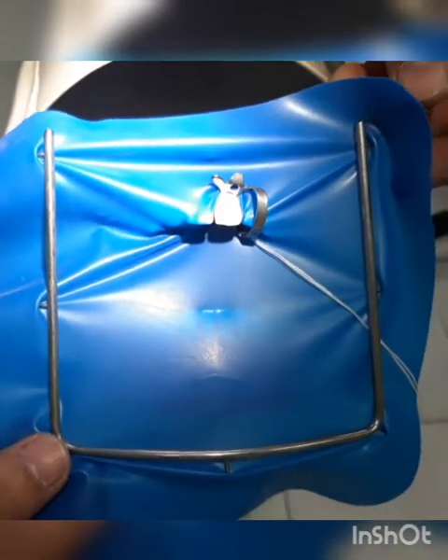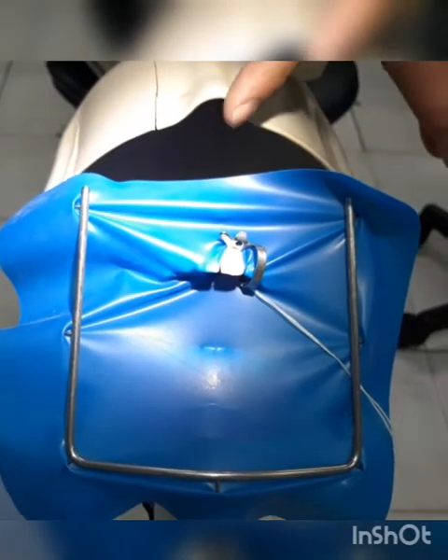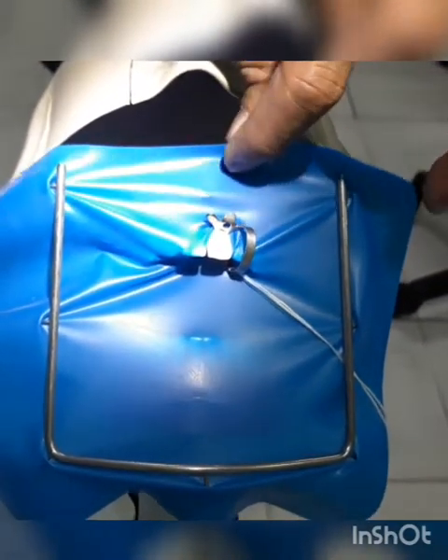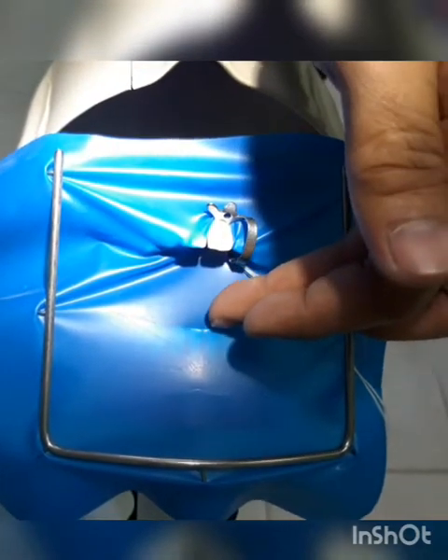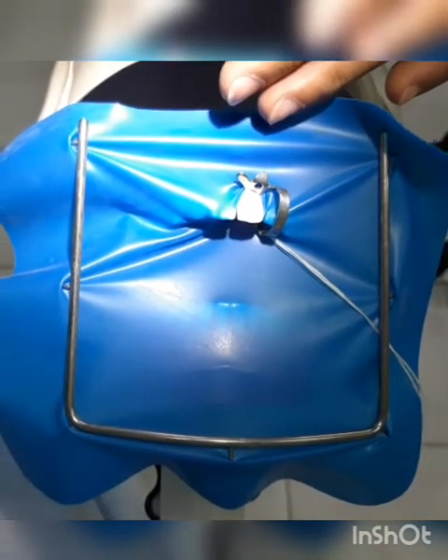Today it is mandatory that the nose of the patient is also covered. You need to punch the hole at least a little farther in order to cover the nose, for infection control.